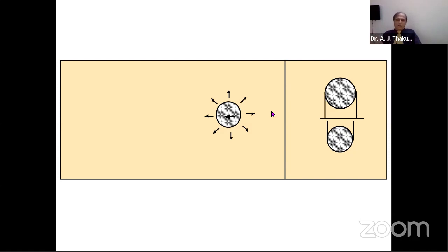So as we pass the pin, it will bite into the bone and will produce a mechanical condition called radial preloading. So the pressure is on all sides. Now when there is an external loading, or the patient takes weight, this pin will not move in either direction because it is tied on all sides.